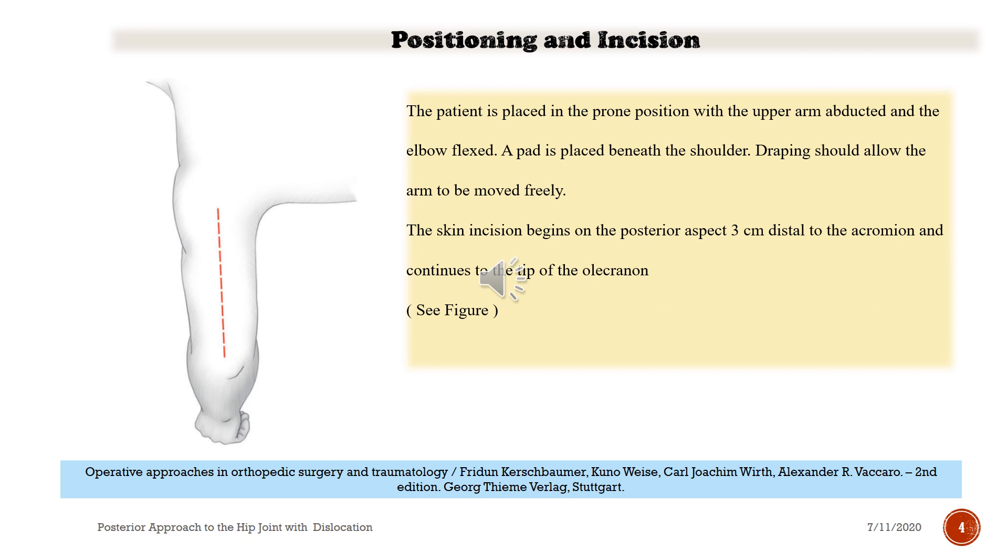The patient is placed in the prone position with the upper arm abducted and the elbow flexed. A pad is placed beneath the shoulder. Draping should allow the arm to be moved freely. The skin incision begins on the posterior aspect 3 cm distal to the acromion and continues to the tip of the olecranon.